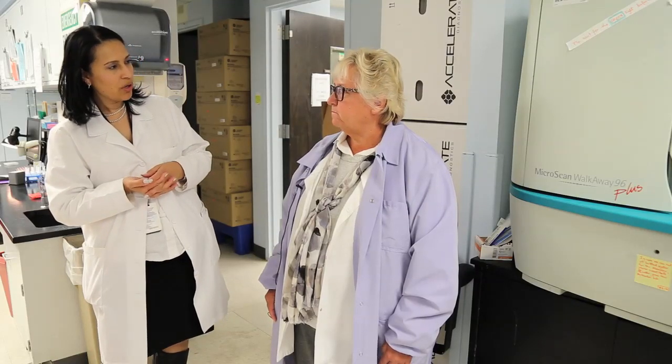Okay. So is there someone who runs the MicroScan for the week, or is it whoever works at a certain bench, like the blood bench or what have you? Each tech prepares their MicroScan on their corresponding benches, and then we have one or two techs throughout the day that run the MicroScan, but we rotate it. So every tech does have a handle on this and is able to do it. And respiratory cultures are also done on this? Yes, respiratory, wounds, blood cultures, aerobic wounds, anaerobic wounds, urines, all of them are run on here. CSF? Yes, that also.